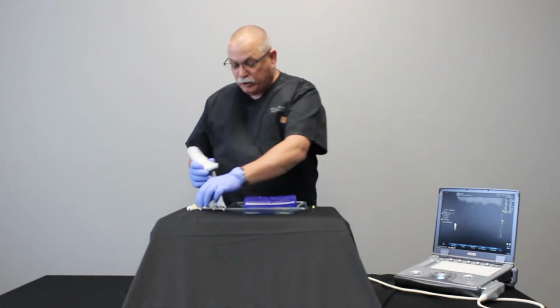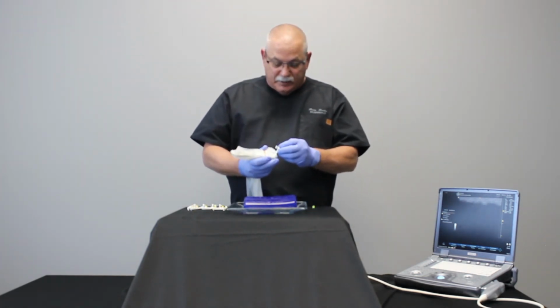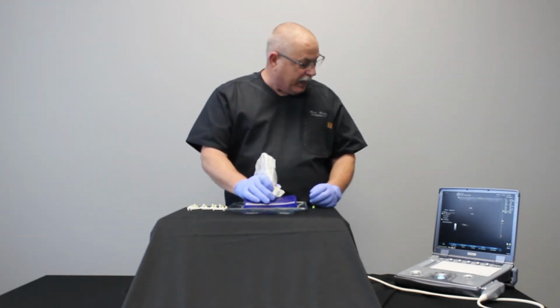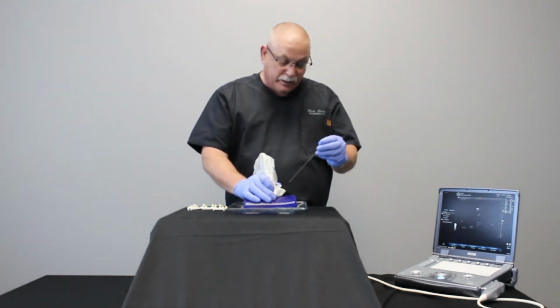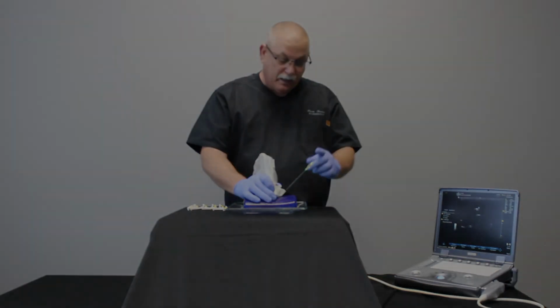So then I will choose the 1 centimeter size guide and attach it to the bracket on the outside of the cover. And then I'll scan again to my target. Then I'm going to introduce the needle. And the first reflection I see will be at 1 centimeter, right there at my target.